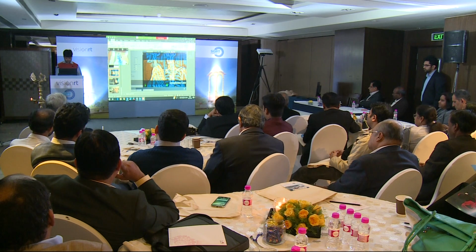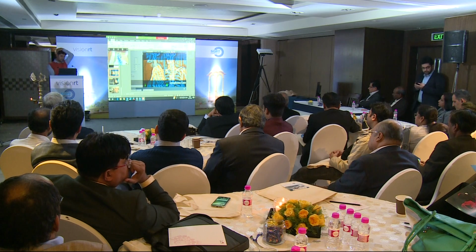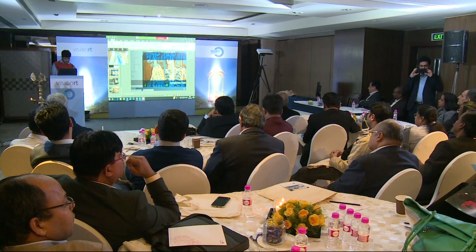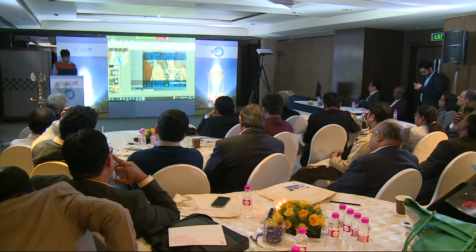And so you can address those posture-type issues very easily and still be using your SGRT systems, your IGRT systems, to do what they do best in aligning to the bony anatomy, but using your SGRT to get that bony anatomy in the right postural setup before it starts.